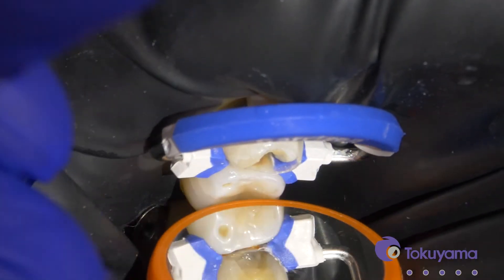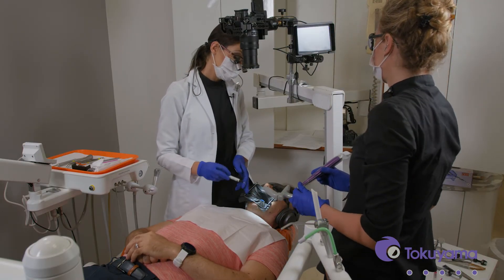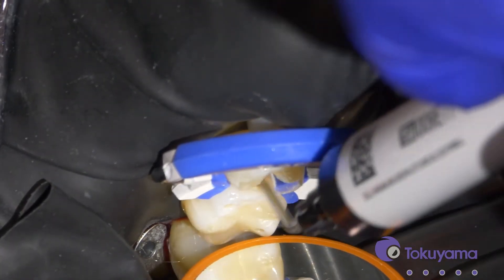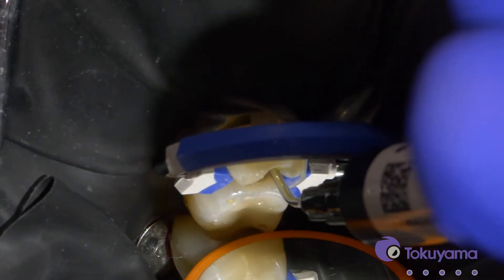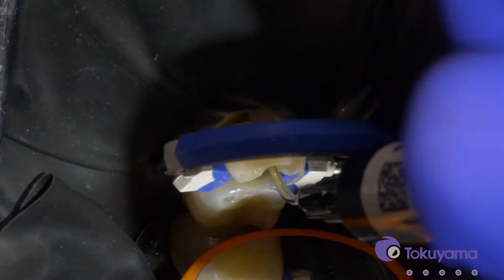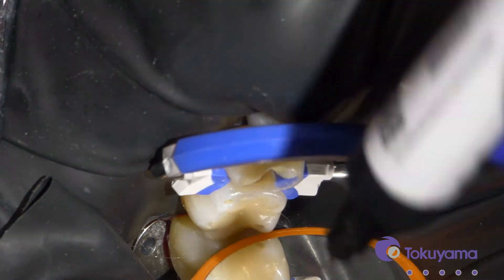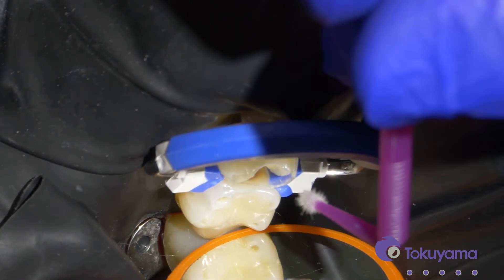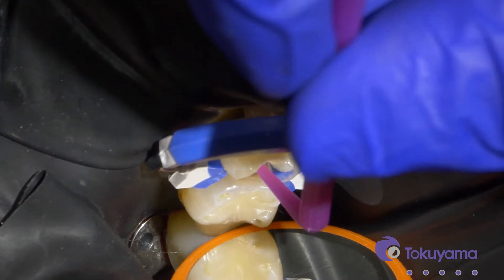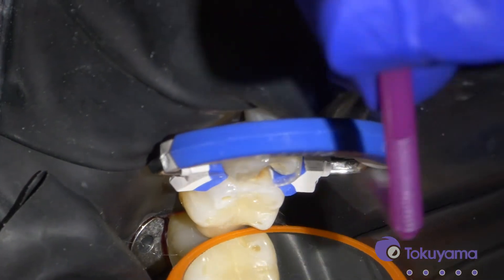That looks a lot better now. I also like to place a little bit of flowable on the gingival floor just to help seal that a little bit. I typically just use the tip of the flowable and apply it and spread it with that — you can also use a brush to spread it out after. Then let's cure that.